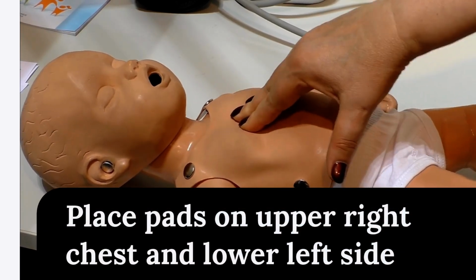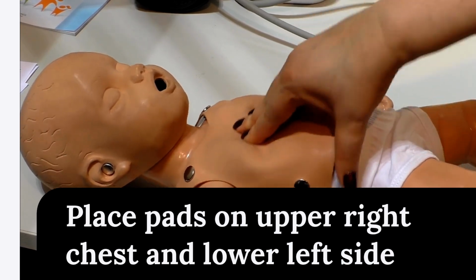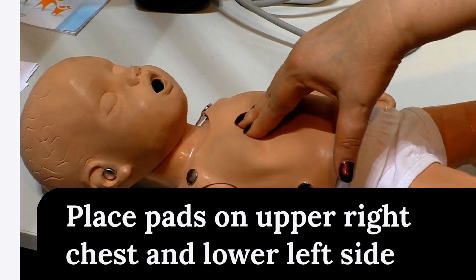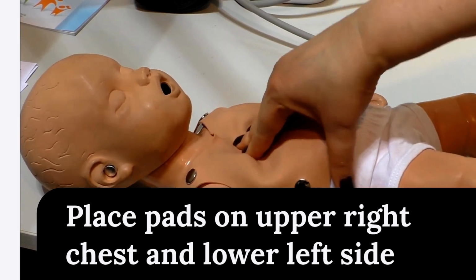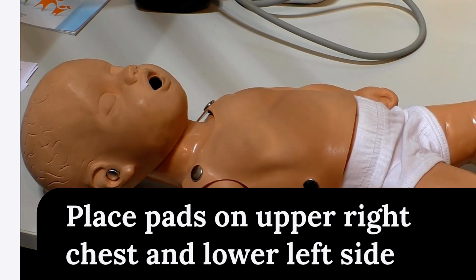For adults, place 1 pad on the upper right chest. The other goes on the lower left side. For children, use pediatric pads if available. If not, place pads on the chest and back. Ensure pads do not touch each other.